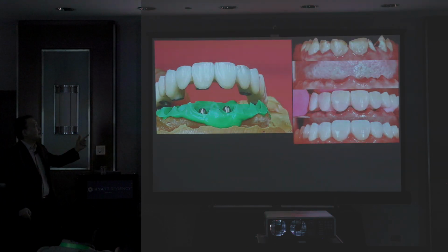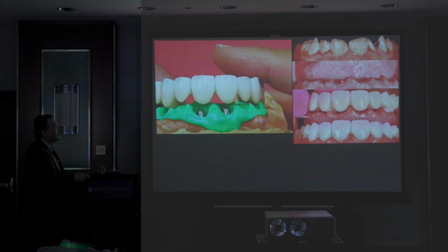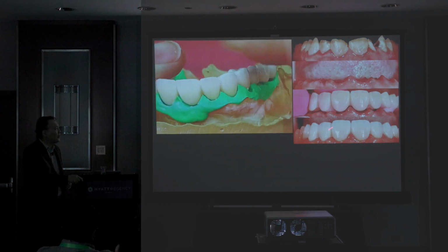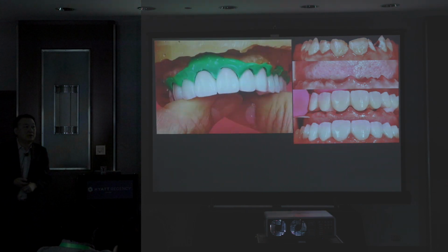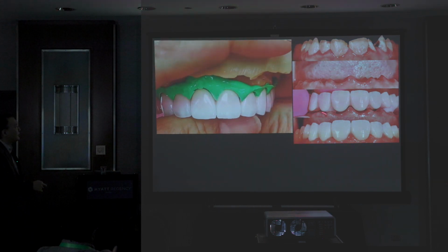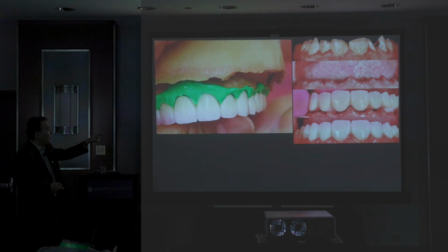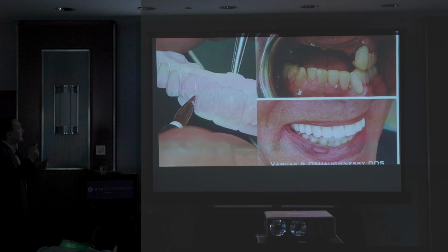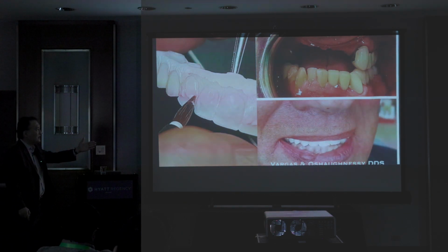Okay, same thing, Stuart Stecco cases. No pink tissue. So he pulled out the teeth, set up the teeth, and placed the full mouth zirconia restoration, which is top of the line, which is very, very cool. Because we don't need pink, we just put it in there. Just like that, and then he took a photo. Same concept, right? And this is what you're looking for, the patient's mouth.